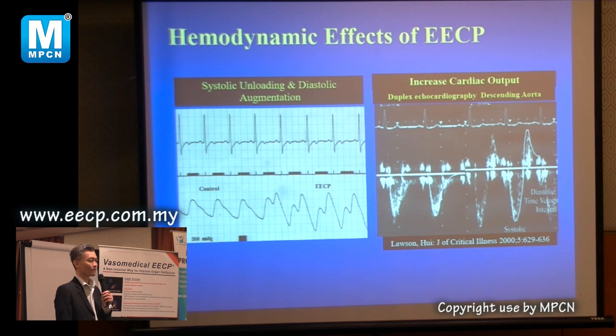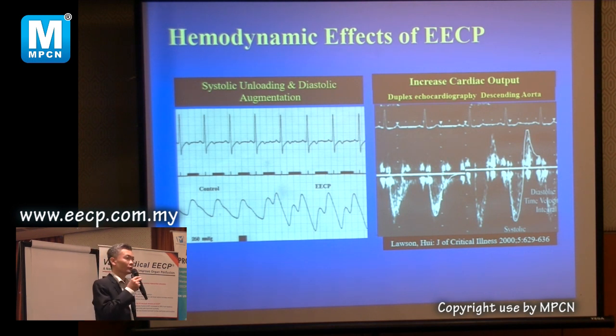And what's different if a person chooses to do it once a week compared to, like you say, 5 days? If you want to do this, you must do the proper 35 sessions. My advice is based on the research, it's not my experience. So you should do the 35 sessions continuously. After that, you can maintain it every 1 week.